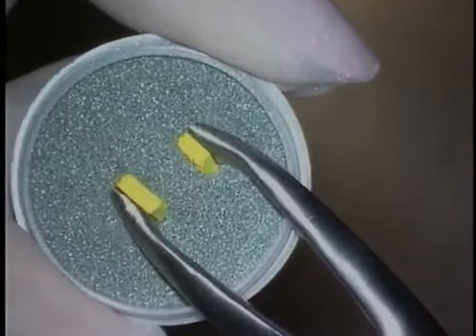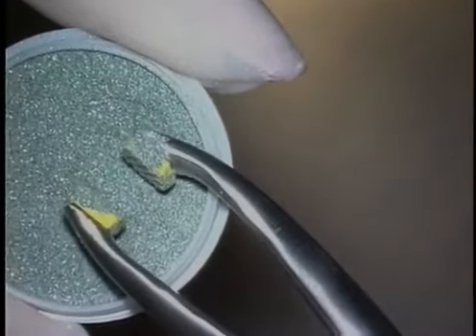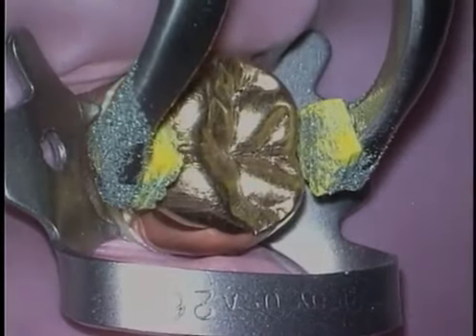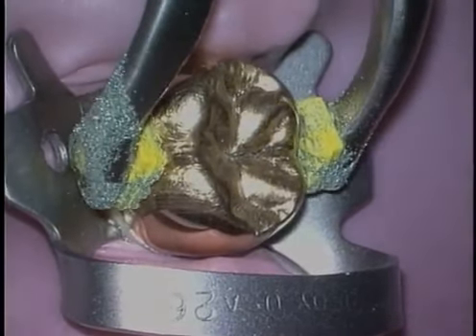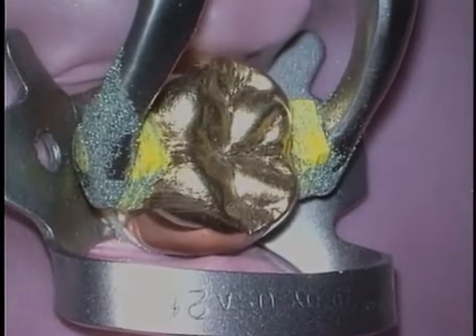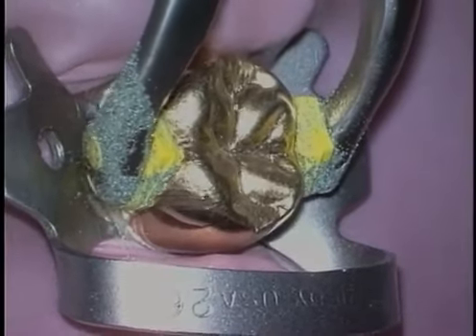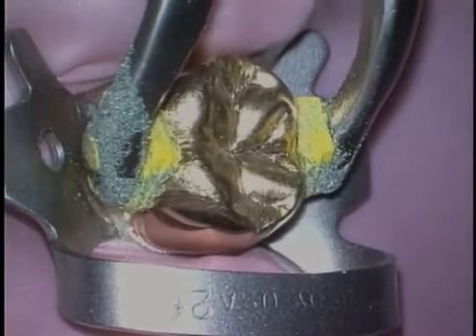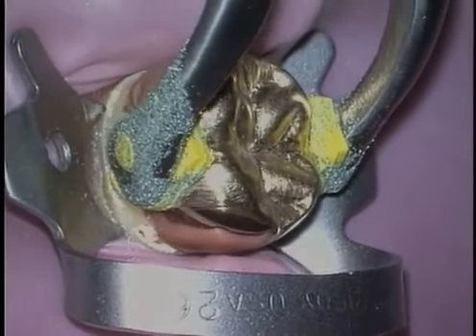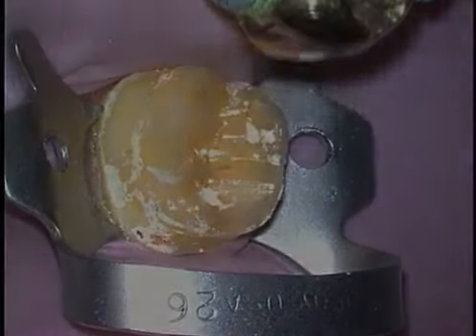The rubber packings can be dipped in emery powder to reduce slippage and encourage a sure grip. Ideally, the jaws of the instrument are placed below the heights of contour on the buccal and lingual surfaces of the restorative. Squeeze the handles of the plier firmly, and then use gentle micro movements and progressively rock the restoration buccal to lingual. Repeated and controlled movements break the luting agent between the tooth and the restorative.